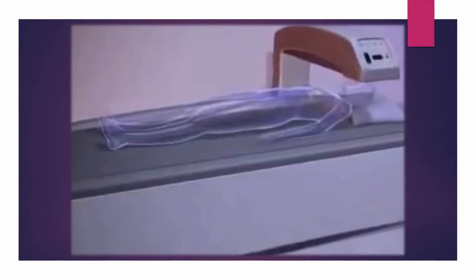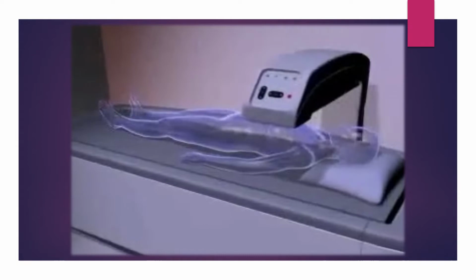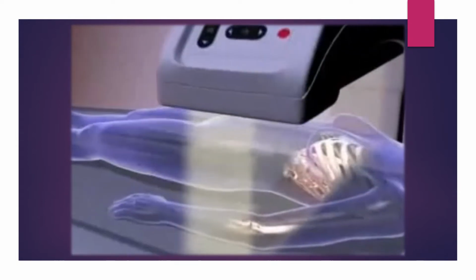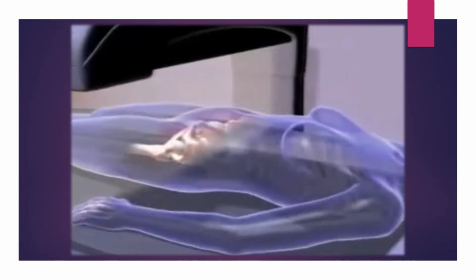Dual energy X-ray absorptiometry measures bone, muscle, and body fat present in the region scanned. The densitometer utilizes two thin beams of low-dose X-rays with distinct energy peaks. These are absorbed by bone and soft tissue, allowing for the calculation of bone mineral content. This content is divided by the bone area scanned to calculate bone mineral density.